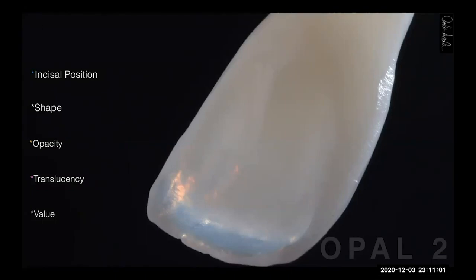That's why you have control of the incisal position and of your shape, because you are not modifying the shape. Normally, when we do ceramic, we modify the shape a little bit. Opacity, why? Because we are preparing the tooth from buccal to lingual. The thicker the wall, the more opacity you have. Translucency, why? Because the thinner the wall, the more translucency you have.